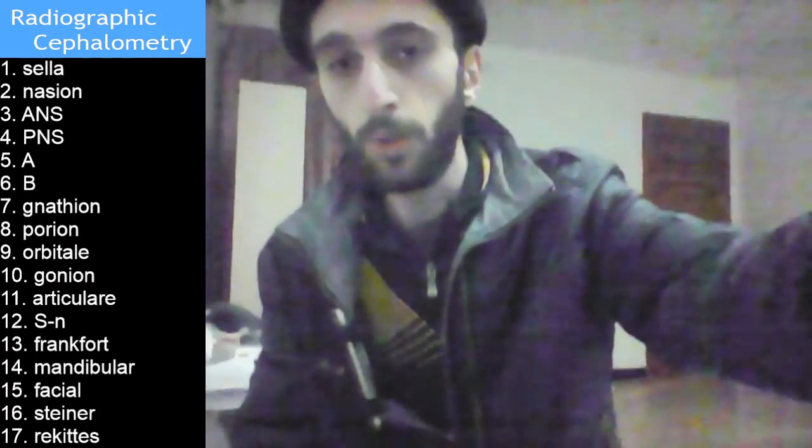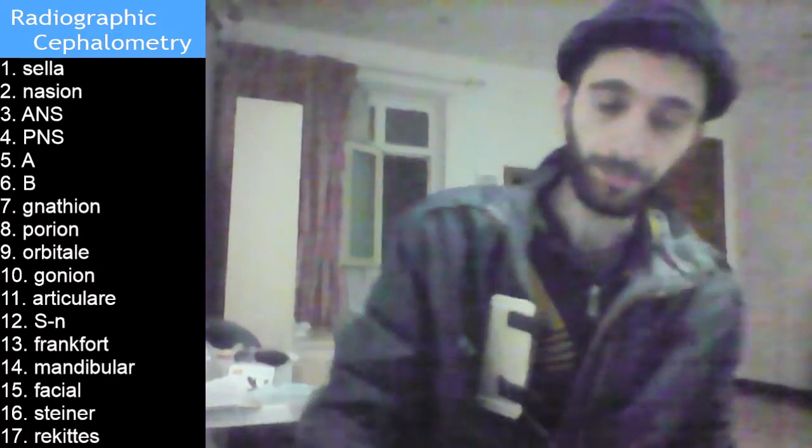For the soft and hard tissue, we use CBCT, cone-beam computed tomography, and we can also use MRI. But usually in orthodontics we do the measurement with radiographic cephalometry to measure some points.